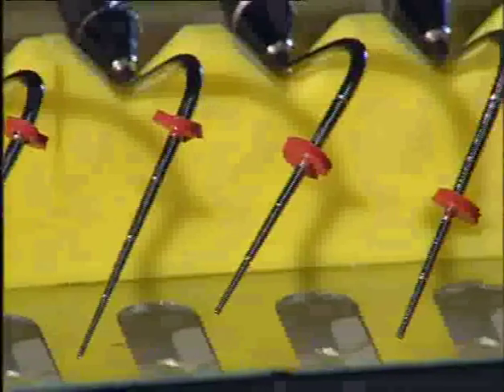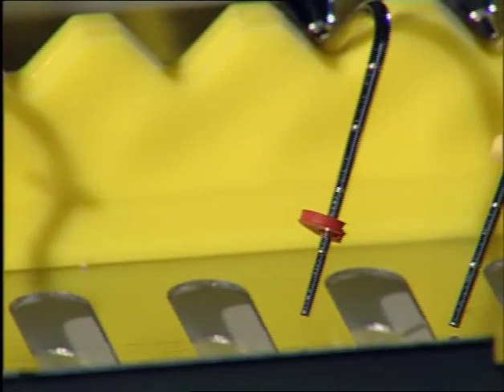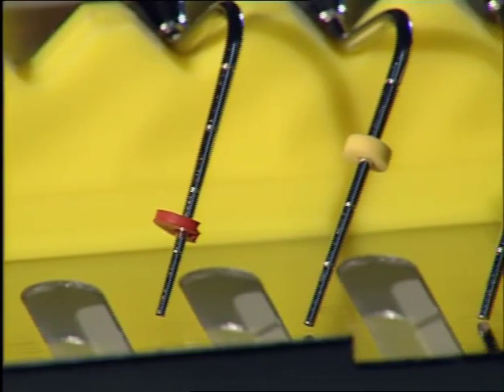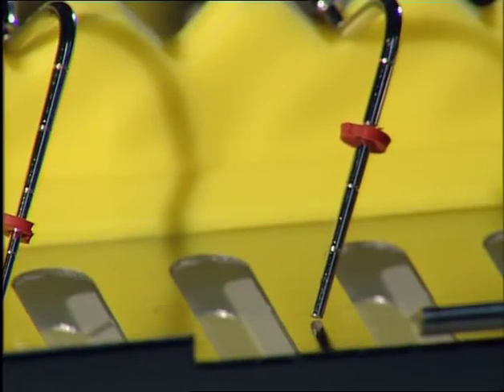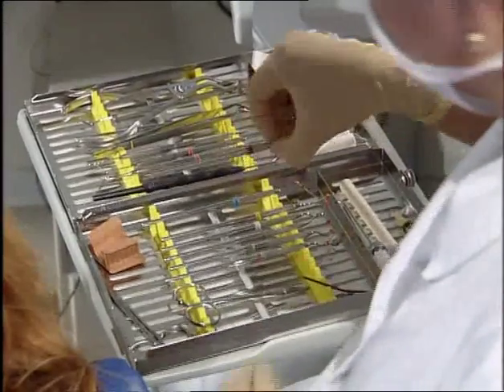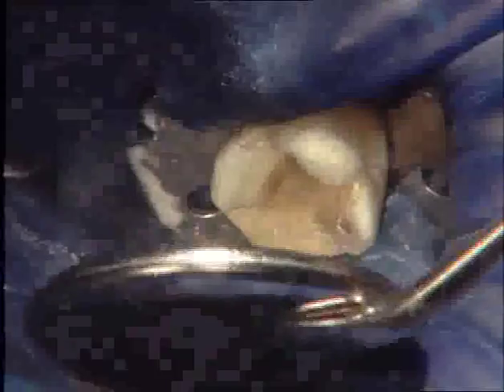The essence of the technique is to capture a maximum cushion of softened gutta-percha and to compact it. Pluggers are selected whose diameter is just slightly less than that of the canal at any given level. Three pluggers are used for any one root canal preparation. They are pre-fitted to the desired length.